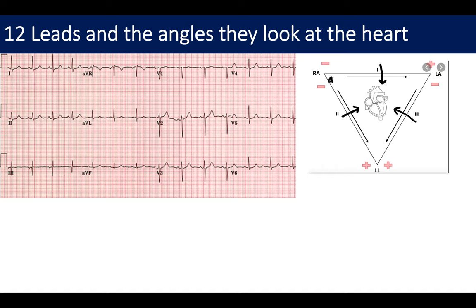aVR stands for augmented voltage right, aVL augmented voltage left, and aVF augmented voltage foot. These three augmented leads add more of a three-dimensional view of the heart. So now you can see the arrows, which show the direction each looks at the heart from.